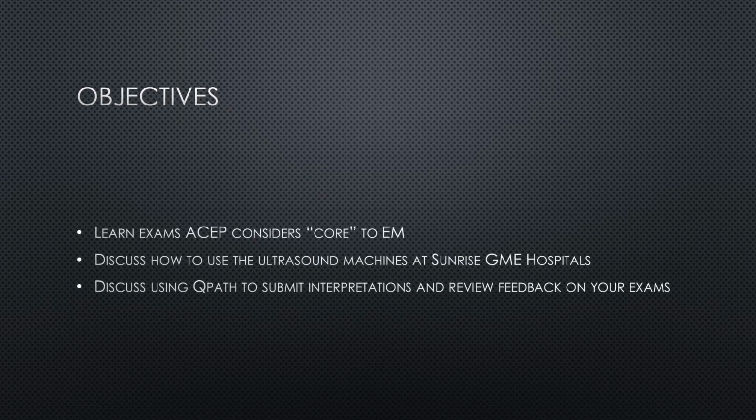So what are our objectives? We're going to talk very briefly about what exams ACEP considers core to emergency medicine. We're going to discuss how to use the ultrasound machines at our hospitals, and we're going to discuss using QPath to submit interpretations and review feedback on your exams.